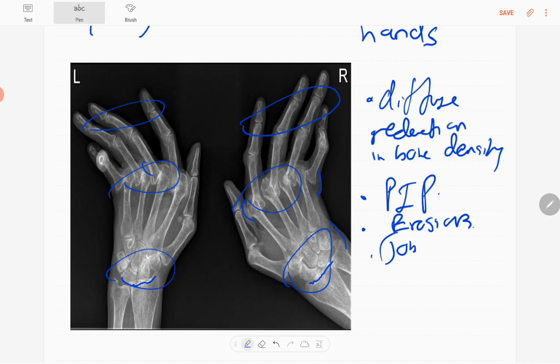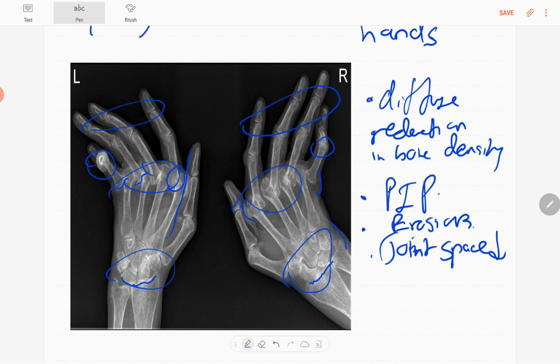Joint space is reduced and erosions are present; however, there is no osteophyte formation and no sclerosis of the joints. You can see multiple dislocations, erosions, and joint space narrowing. Soft tissue swelling is also present. The thumb is relatively preserved or spared.